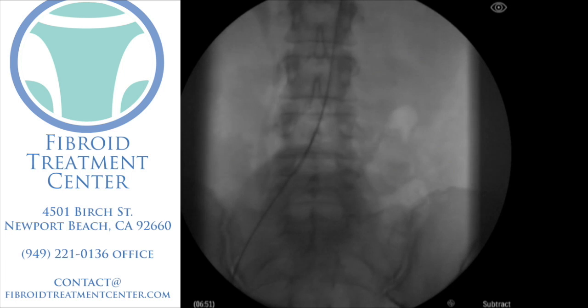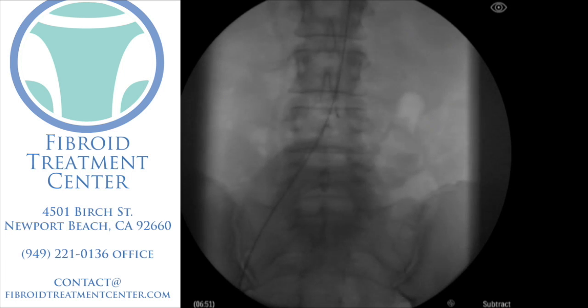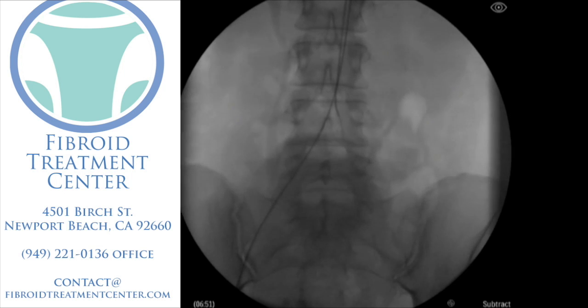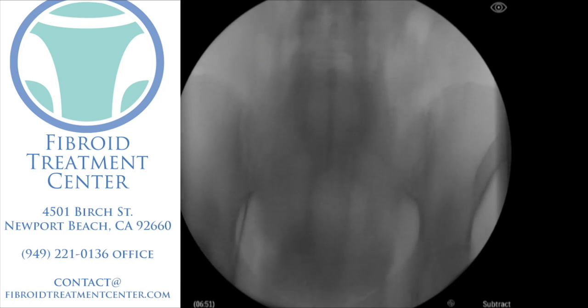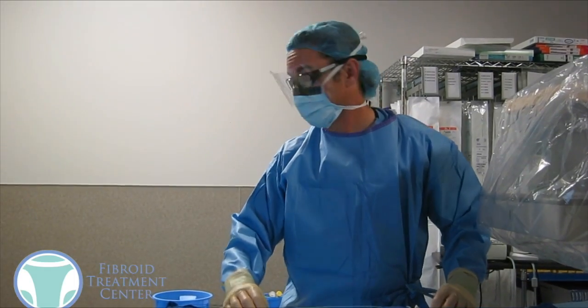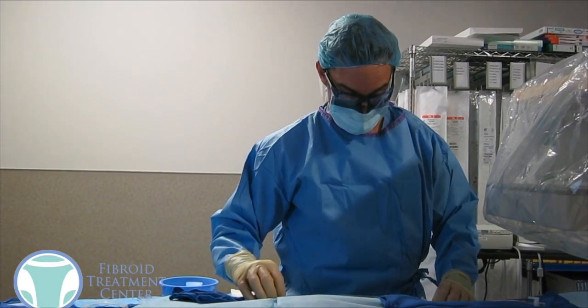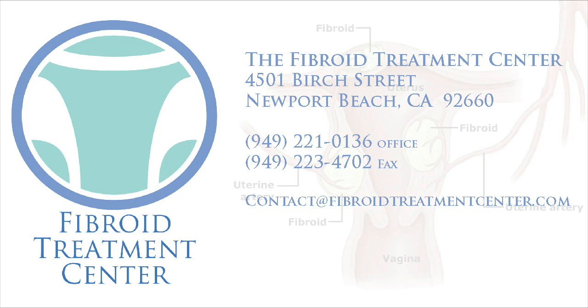Once those are completed, we know that we've done the complete uterine fibroid embolization. We're going to remove the catheter, steering it into a position where we can take it out. Once the catheter is out, we use a small device to seal the artery where we had put the sheath in, and then that's it. A woman will recover for a couple of hours and then be free to go. We hope that helped — we encourage you to ask any questions, email our office, and we'd be happy to schedule you for a consultation if desired.